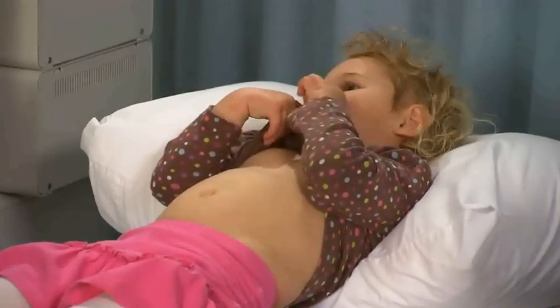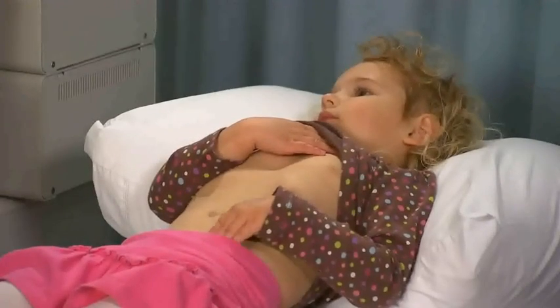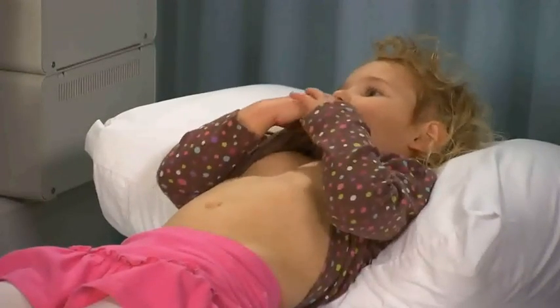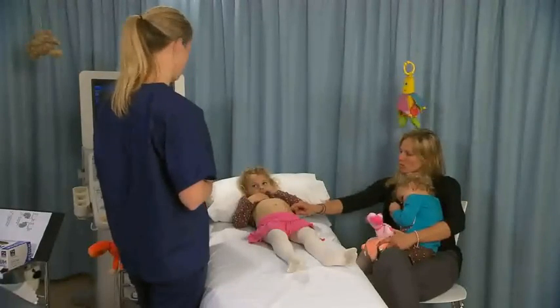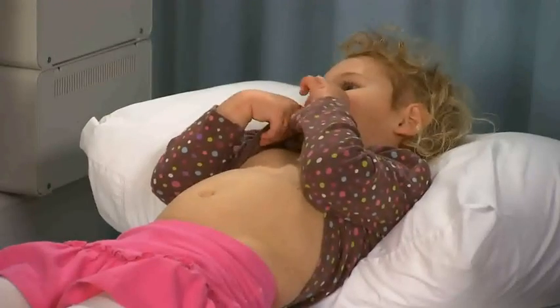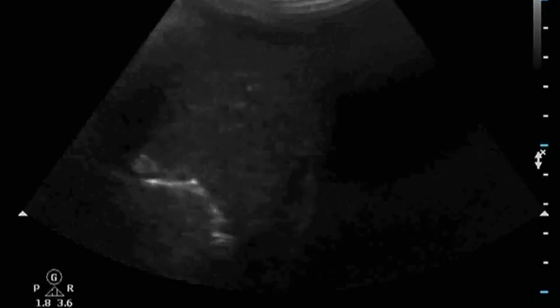Ask the child to lie on their back as still as possible. Ask the patient to hold their breath, but as younger children are often not good at controlling their breathing, images must be captured during the child's normal inspiration or expiration. Children are good at pushing their tummies out to make them look fat, and this can help with the visualization of the organs.